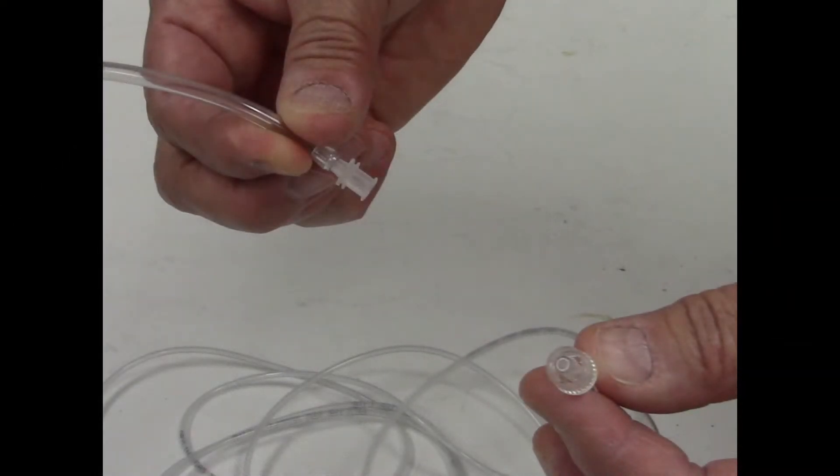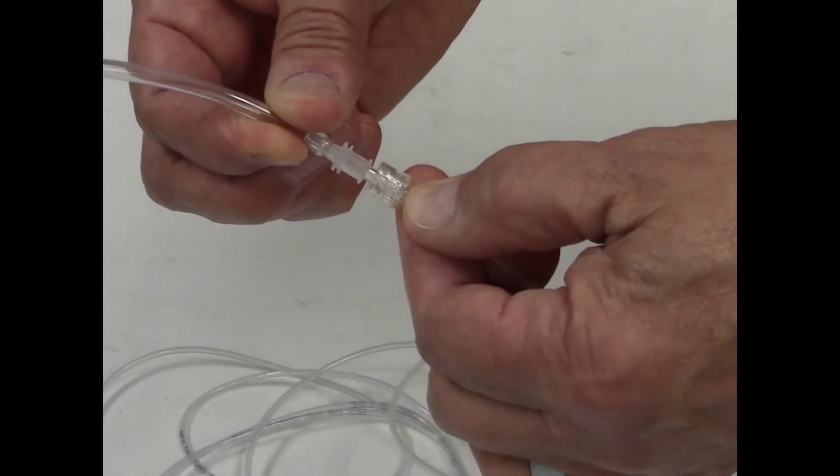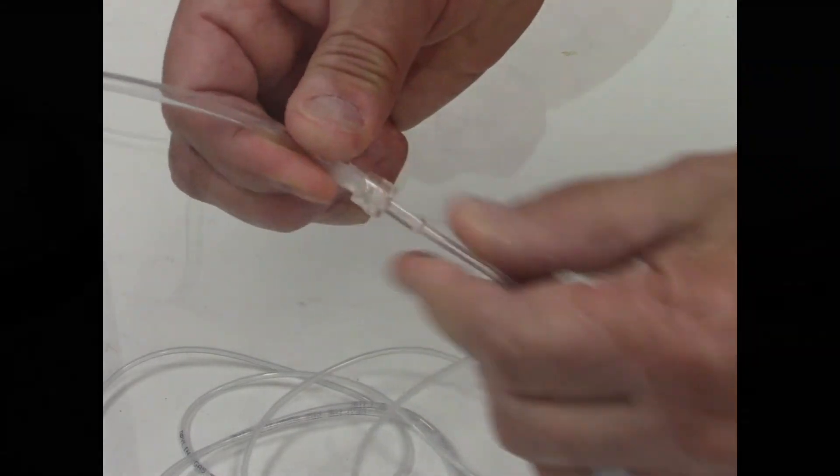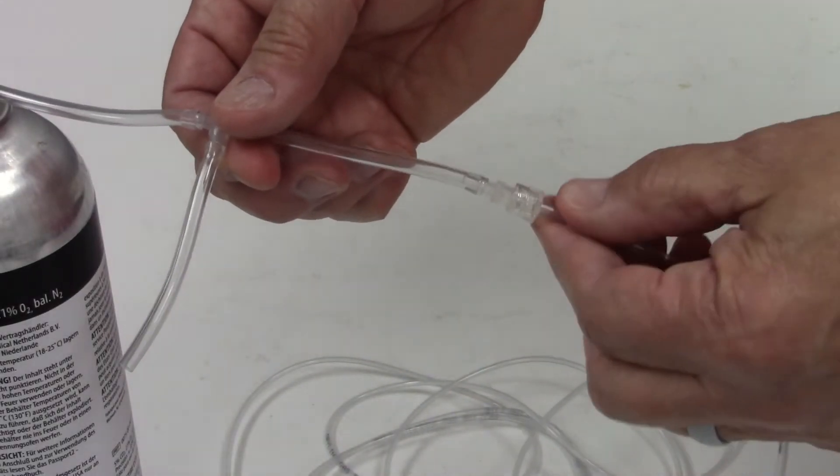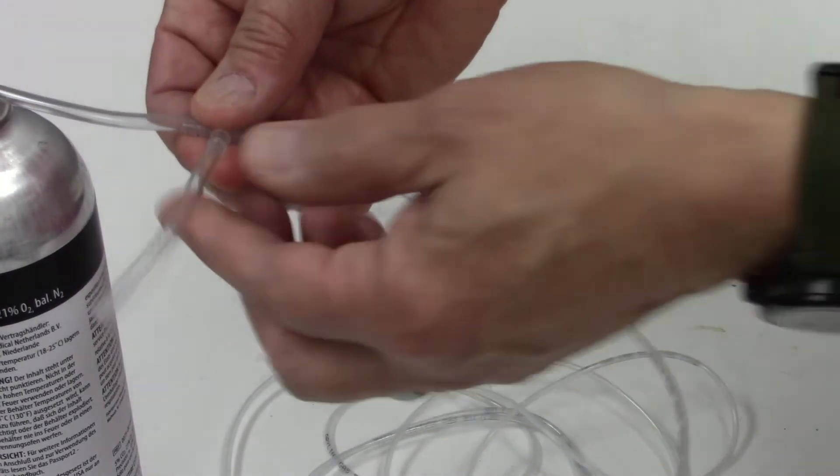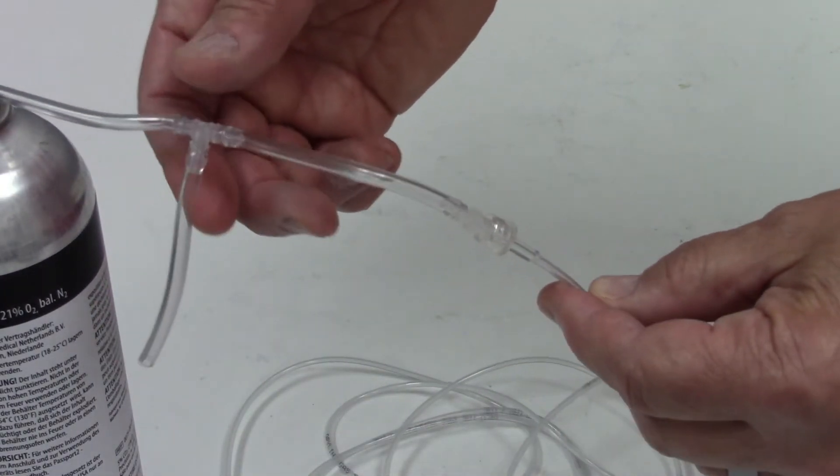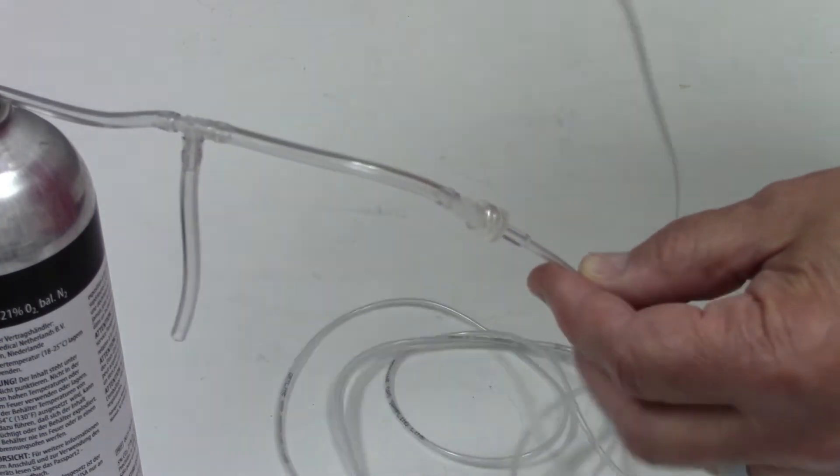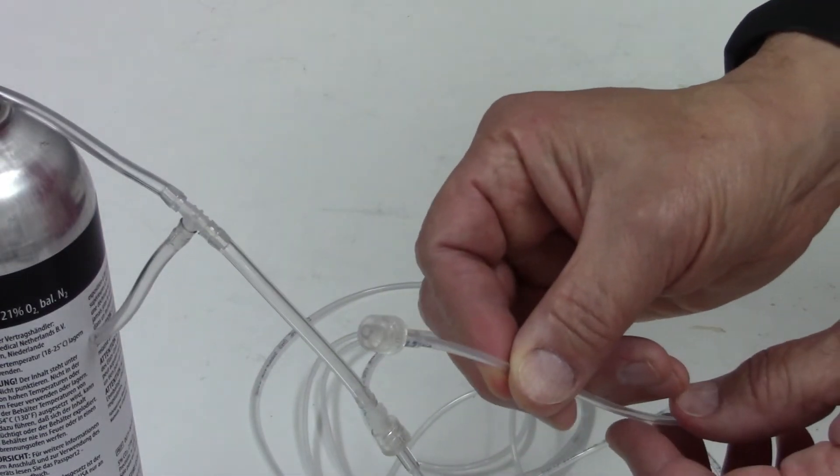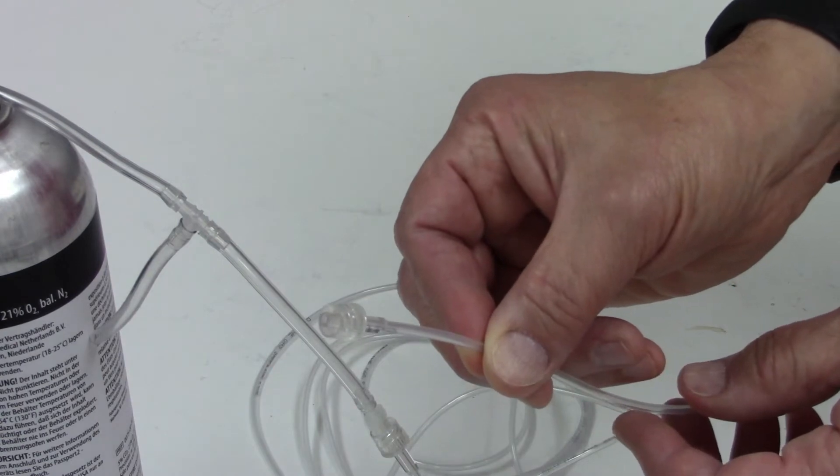When you calibrate your CO2 module, attach the sample line to the T-fitting supplied with the gas. Make sure your T is open to atmosphere so you don't pressurize the CO2 module. Connect the other end of your sample line to the CO2 module to be calibrated.